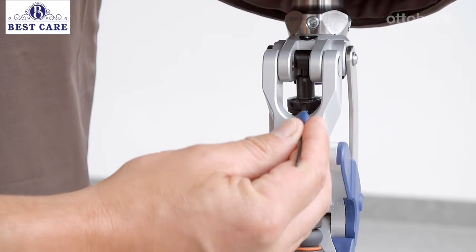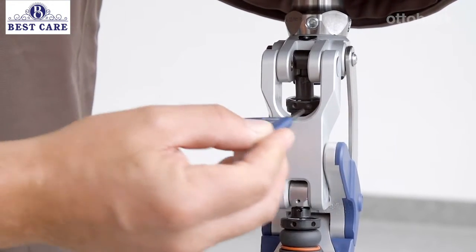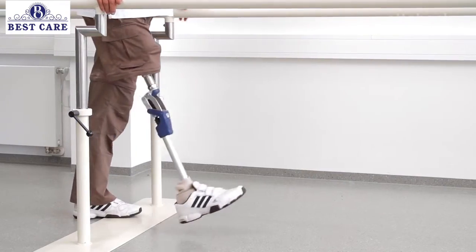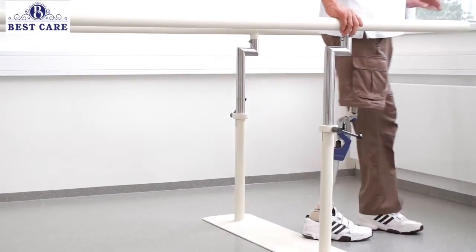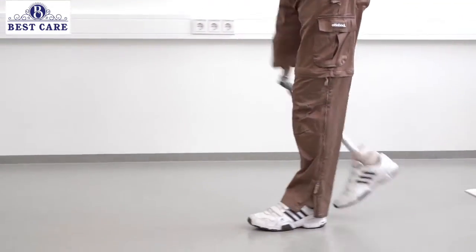During swing phase, the spring effect of the extension assist prevents the knee from flexing too much. The extension assist is adjusted by turning the upper adjustment ring. As shown in the video, a spring tension that is too tight will cause the knee to flex too little, and the shank will swing forward too quickly. This results in a hard extension stop.